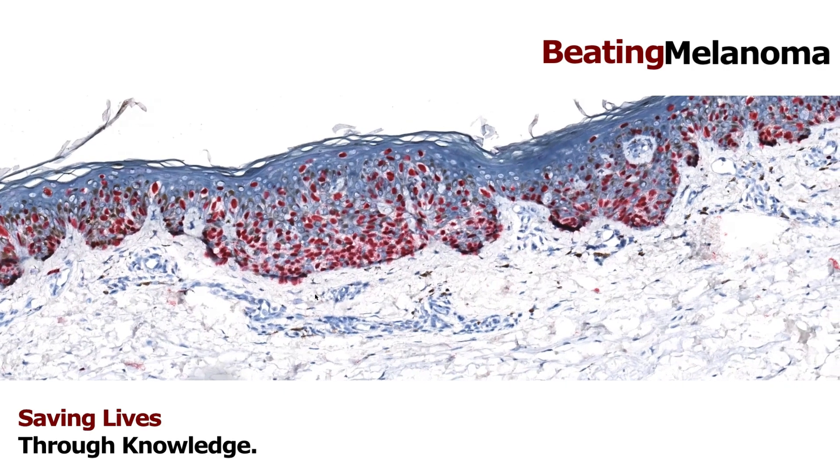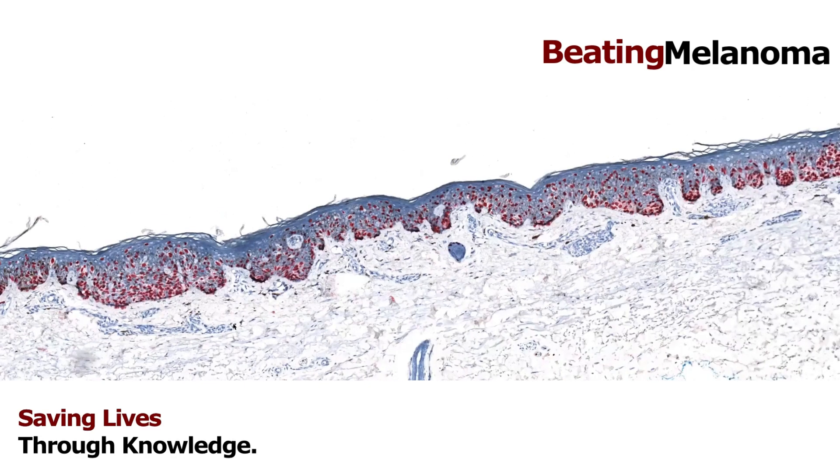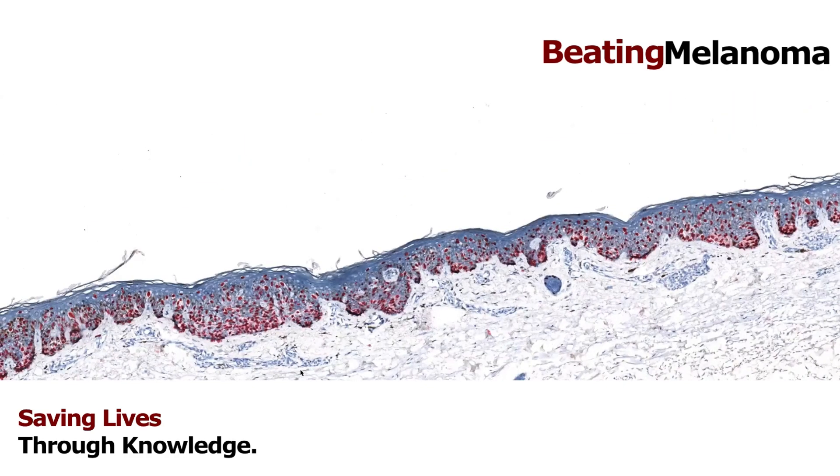The melanocytes are still abnormal, but they have not invaded down into the dermis. The good thing about this is it still needs to be removed and treated, but if it's removed completely the chance of anything bad happening is very, very low — close to zero. Generally, melanomas can only spread to other parts of the body or cause death if they invade and get into the blood vessels or lymphatics. Melanoma in situ, if caught while still in the epidermis, doesn't have that potential to spread. This case was totally in the epidermis with no invasion into the dermis.